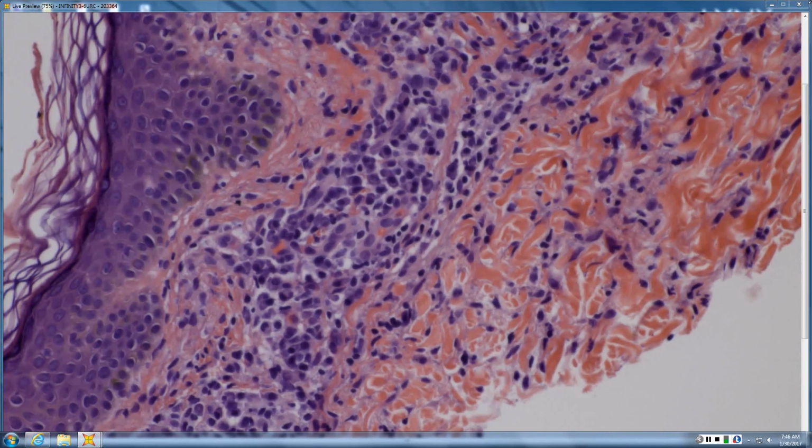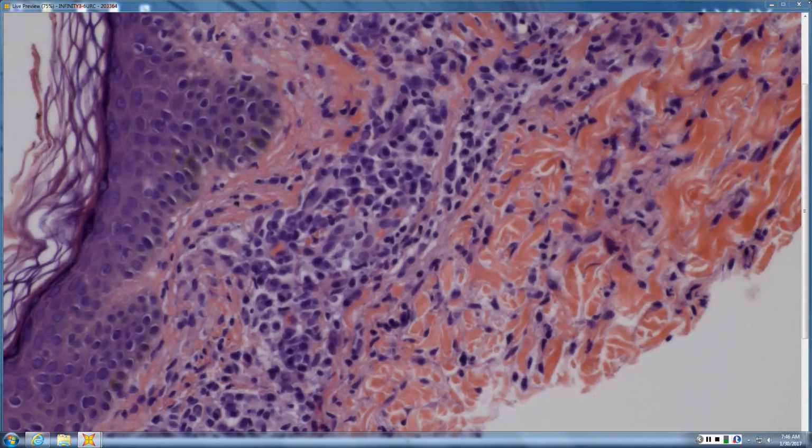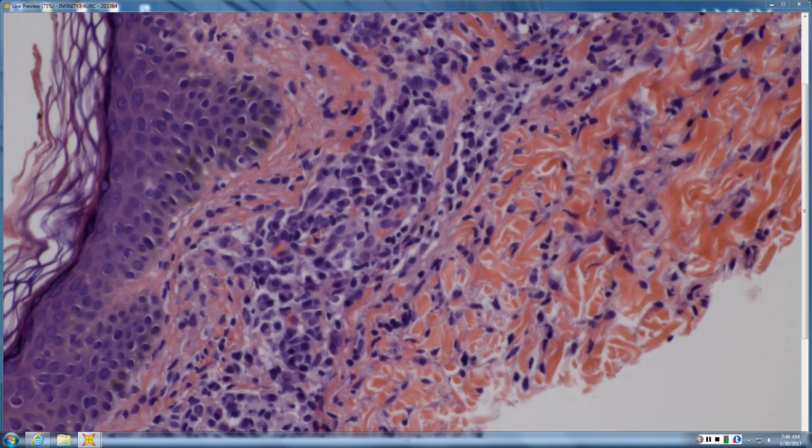Did the 3 cases of syphilis we saw look alike, or did they look very different? They looked very different. Osler called syphilis the great imitator because it does anything except vesicular or bullous lesions in an adult. You have to have a high index of suspicion, but there are some commonalities.